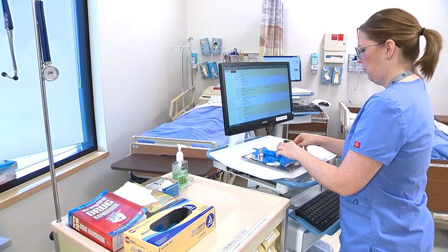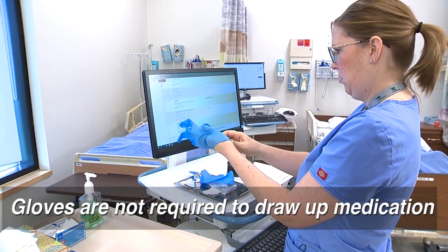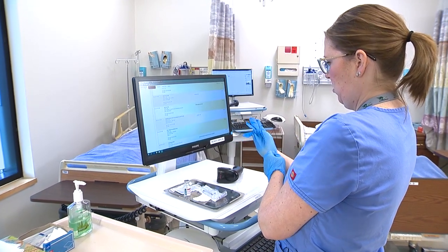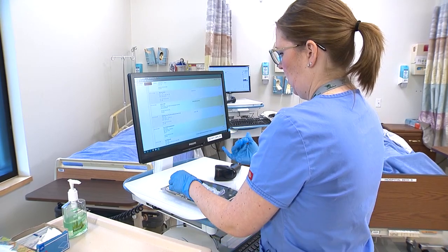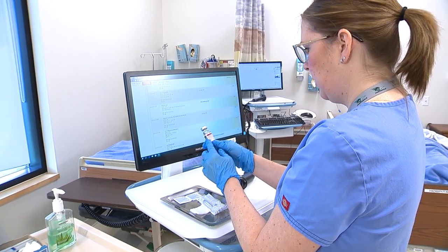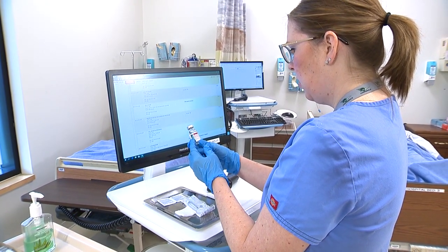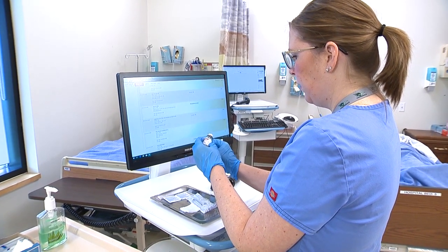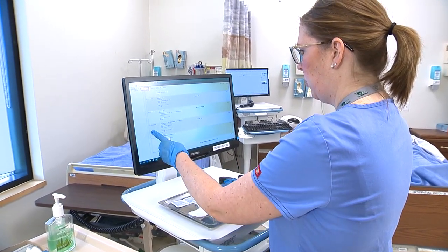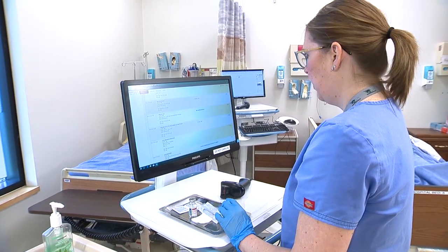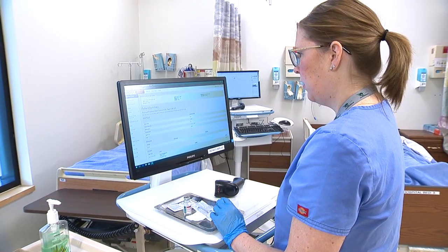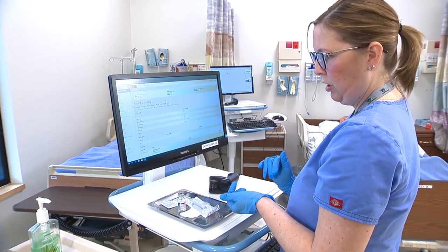I'm going to take everything here. I'm comparing my medication to my physician's order: pneumococcal vaccine, 0.5 mL per dose. The expiration date is 2/2054, so we're good. I'm going to give this IM — it says IM or sub-Q. It's ordered today for patient Morgan Brown, no known allergies, date of birth August 4th, 1970. I will complete documentation upon administration.